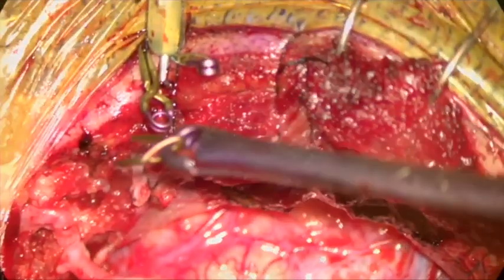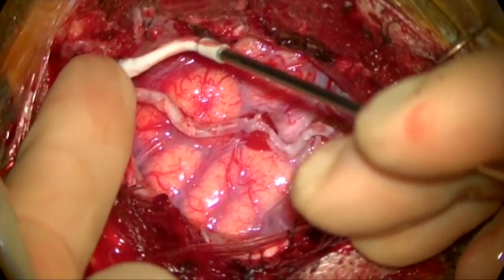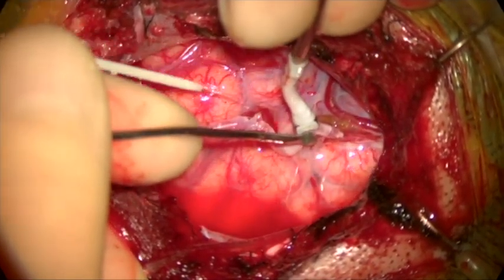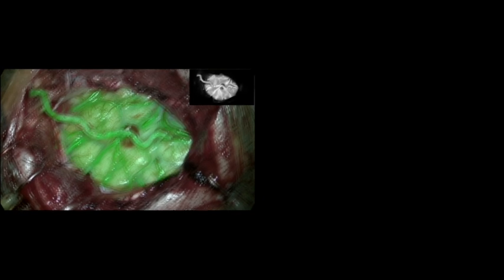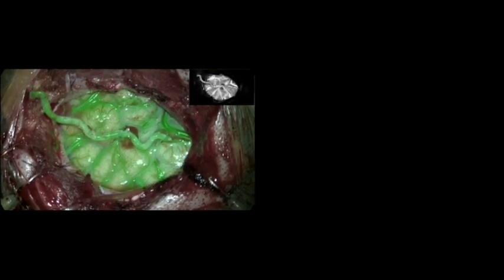I measure the flow, and it is not surprising that it is 60 cc per minute, which is higher than the cut flow at the beginning because we performed two anastomoses with the same vessel. The Glow 800 also helps us to visualize very well the donor vessel and the entire recipient bed.